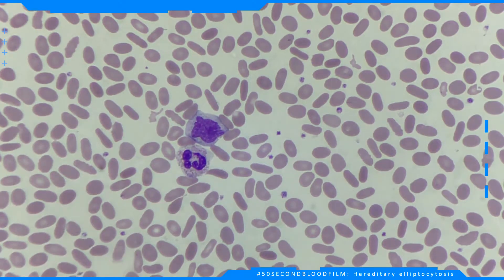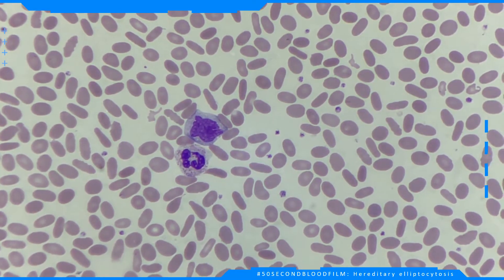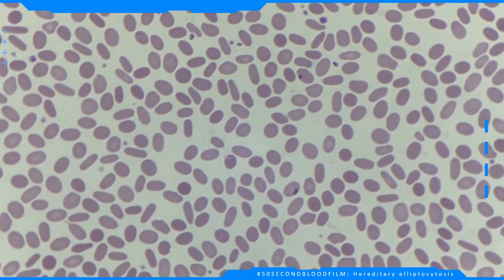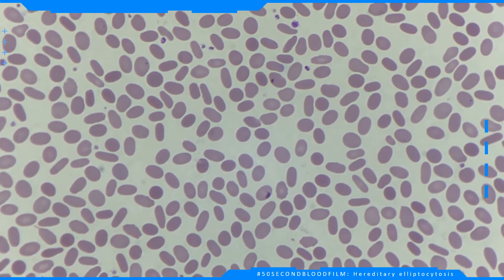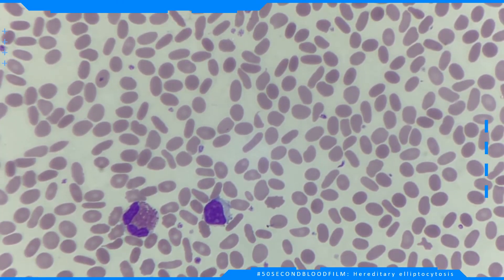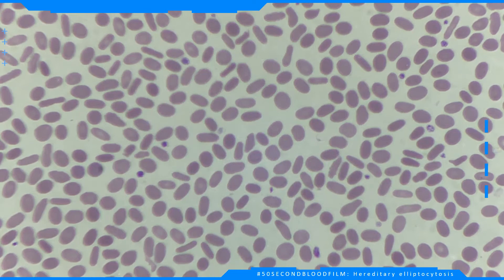This blood film is from an adult male who had gone to their general practitioner for a routine checkup. The full blood count results were generally unremarkable, with a white cell count of 4.74, haemoglobin of 136 grams per litre, and platelets of 248.